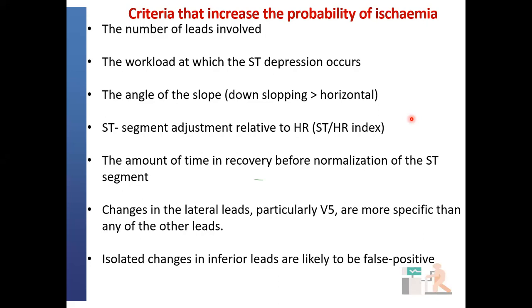Then the amount of time in recovery before the normalization of the ST segment. For instance, during the recovery period, usually by the third minute in normal individuals, you are expected to have normalization of all the changes, including the ECG changes. The heart rate must have normalized to baseline, and the recovery of blood pressure must also have been complete by the third minute. So if it takes longer, maybe up to 6 minutes or beyond before normalization of your ST segment changes, it increases the probability of ischemia.